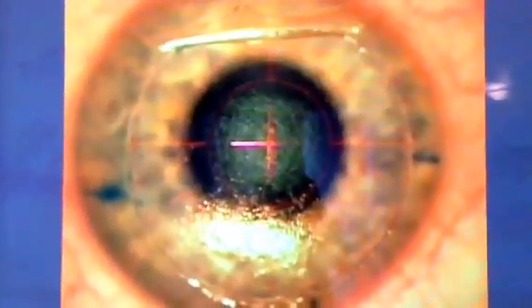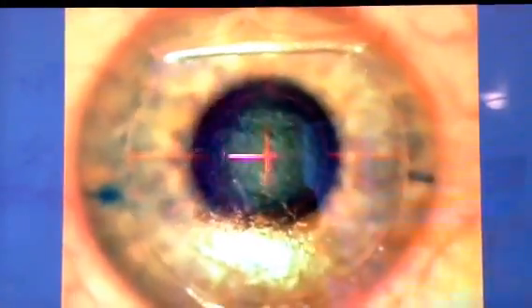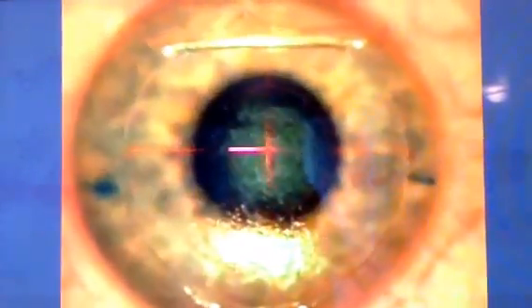You can see the laser flashing. He just pulled out.